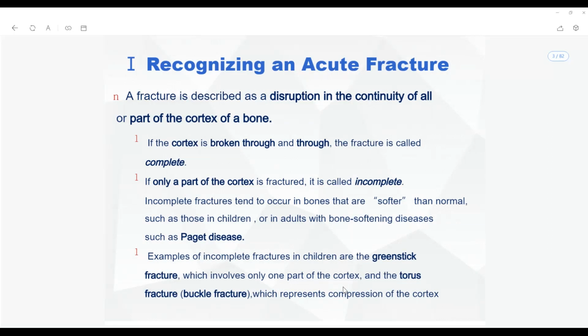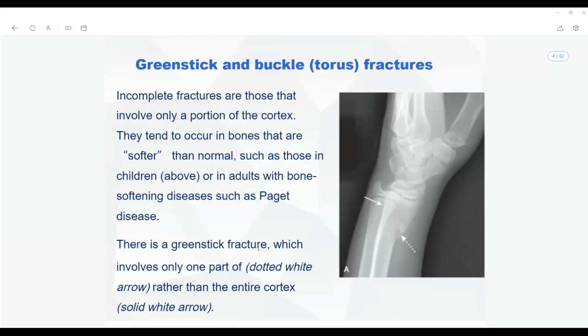Remember the qualities first. Right, how you make an assessment related to the quality of the abdomen x-ray. When you are determining the quality of a chest x-ray, there are also some rules and regulations related to the skeletal x-ray.